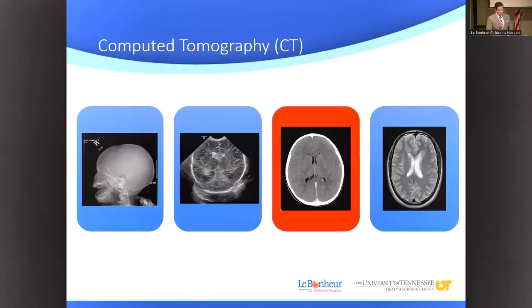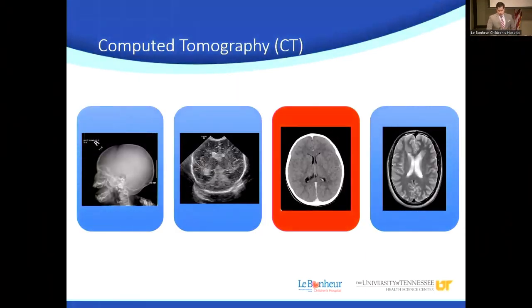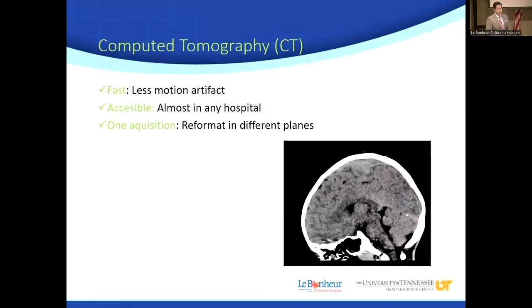So I love ultrasound. For CT, this is what I'm going to talk a little bit more about. The following lecture is actually going to be Dr. Siddiqui talking about brain trauma. I have some trauma cases over here, but I'm just going to fly through them and give you just pinpoints. Okay, so for CT, why is it good?